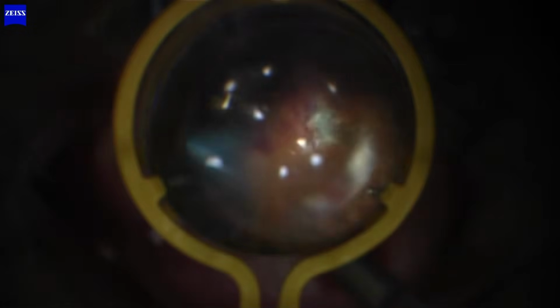Here, we show a case of a patient undergoing pars plana vitrectomy for non-clearing vitreous hemorrhage due to proliferative diabetic retinopathy. To contrast the view provided by our new contact lens system, here is a microscope view with the standard non-contact viewing system that comes with the ReSight. You can notice the optical clarity is somewhat limited by glare and reflections of the microscope light.